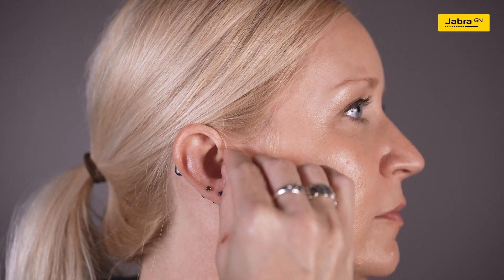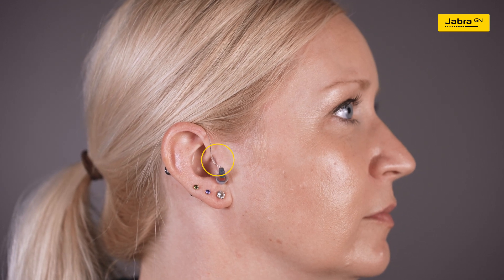Hang the Jabra Enhance Pro 10 hearing aid over the top of your right ear and hold the receiver tube where it bends. Gently push the receiver dome into the ear canal. Ensure that the dome is far enough into the ear canal so the receiver wire rests against your head.